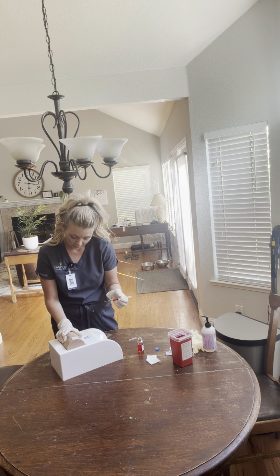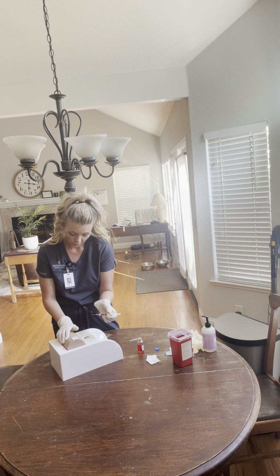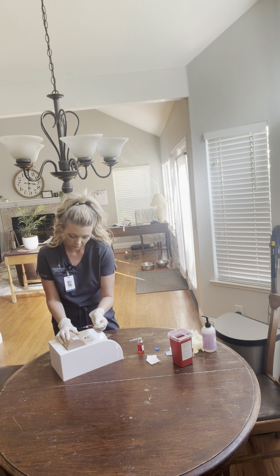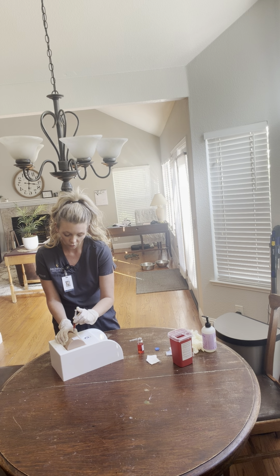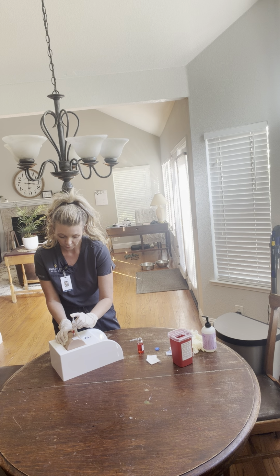I'm going to put this down, and I'm going to pinch, and I'm going to remove my marker at the same time. Now this needle needs to go in at a 90-degree angle. It needs to be administered 10 seconds per milliliter.